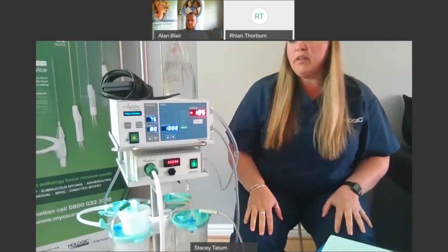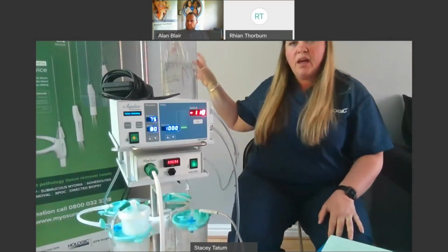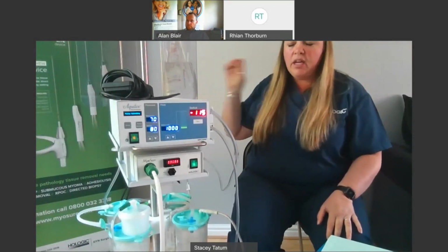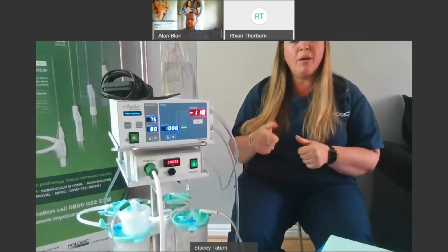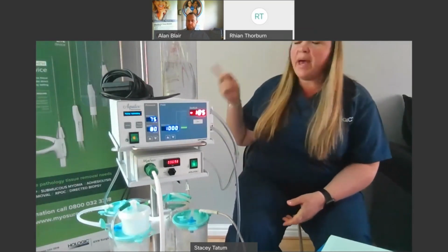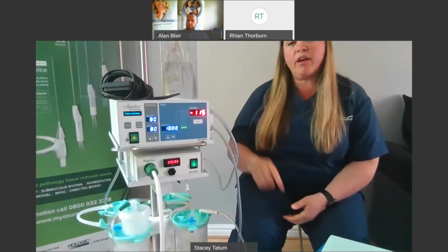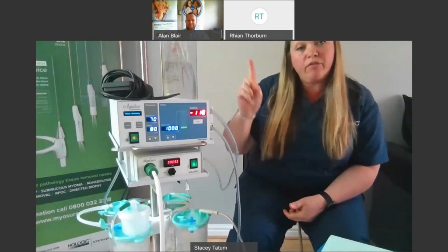So the next most popular troubleshooting we come across is when the bags have run dry. So you can hang two bags, you can spike two bags at the same time, but only have one unclamped at a time for best performance. But if the bag has run dry, what you'll hear around the wheel is like a flat tire noise, and your fluid deficit will be rising.